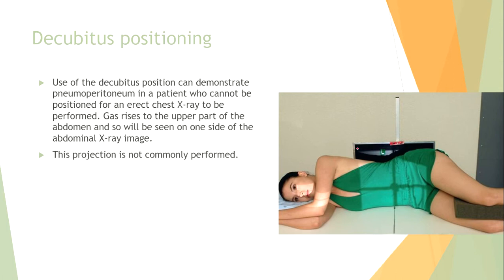You must understand why we lie the patient on the left side. This is the wrong picture. We must lie the patient on the left side, not on the right, because on the left side of the body we have the stomach and it contains a gas bubble. Sometimes when we put the patient like this, we look at the picture and see free gas, but it's not free gas, it's only the gas bubble of the stomach which touches the abdominal cavity wall, and so we can perform an operation without need. And we break the main rule of all medicine: do no harm.